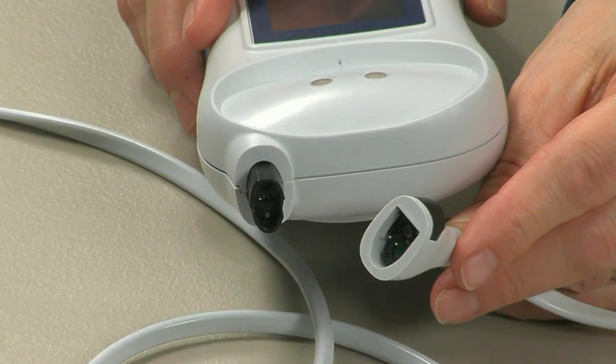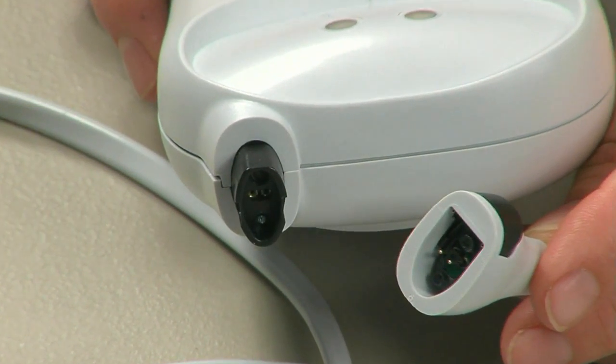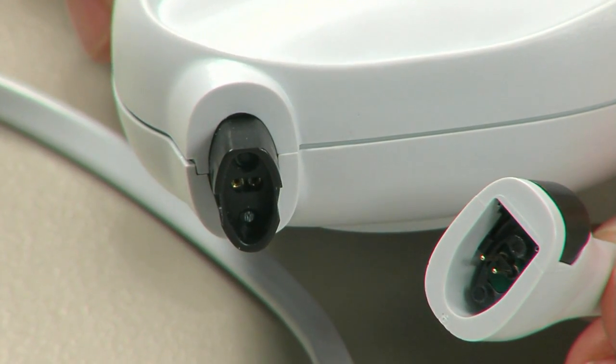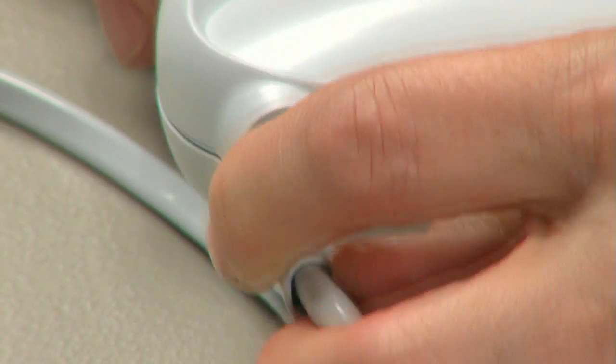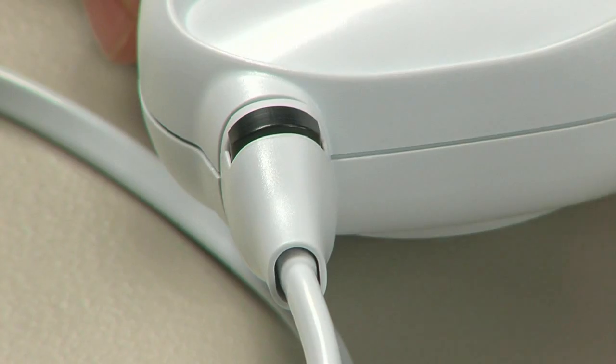Next, attach the optical cable to the InSpectra STO2 SpotCheck. Align the button on the cable connector with the connector on the top of the device and push to secure, taking care to not bend the pins.